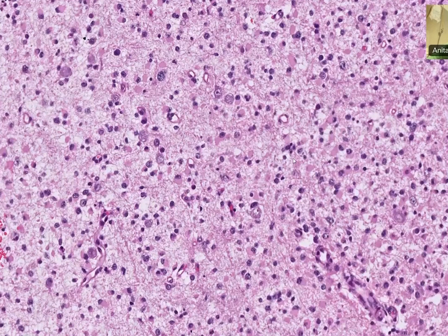Anybody else in the team? Can anybody describe this slide? So there are multiple round to oval astrocytes having abundant eosinophilic cytoplasm, showing nuclear atypia. There is pleomorphism and hyper. Can you elaborate one feature? So when you say astrocytic, what does it mean? Is there any particular feature to be called astrocytic? So there's eosinophilic cytoplasm, but that is only one form of it.